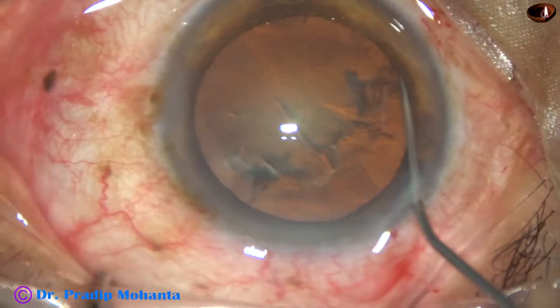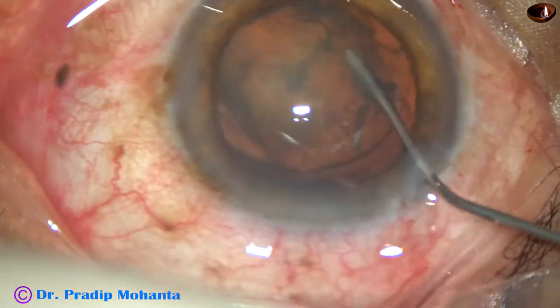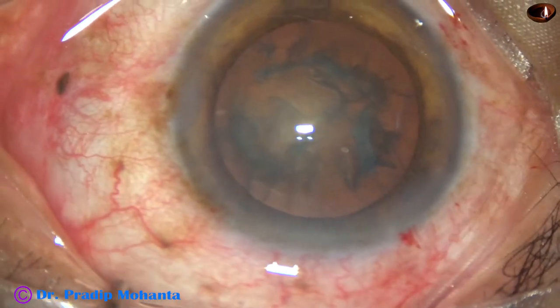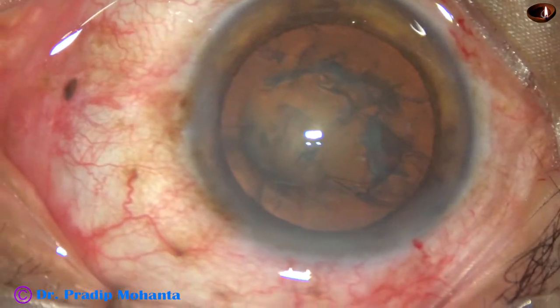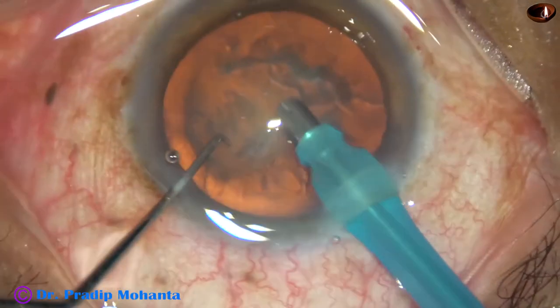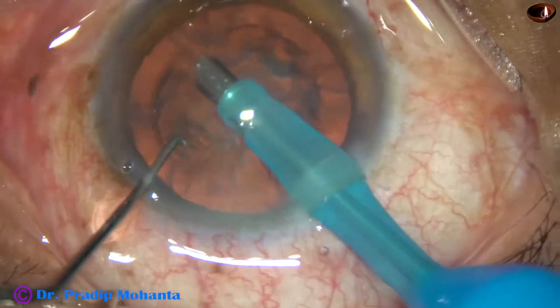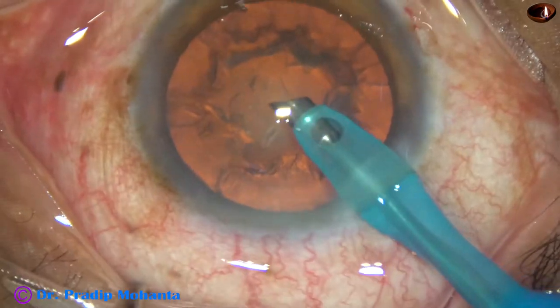The nucleus is tapped and rotated, and now some visco is injected. Then the tip of the phaco needle is introduced into the anterior chamber. Some superficial cortical lens matter is removed.